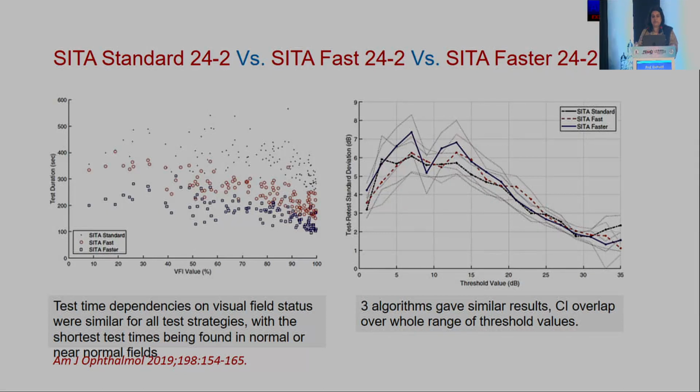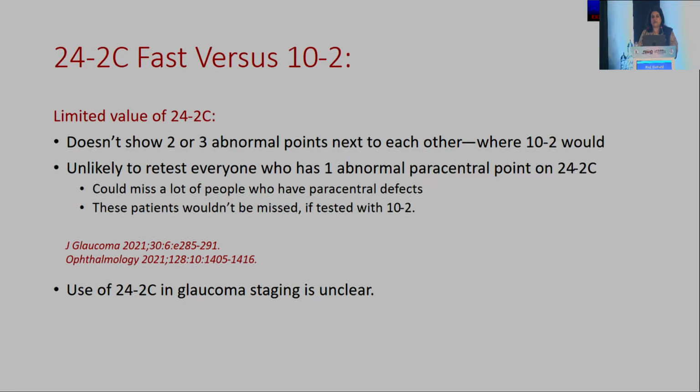The test time depends on the visual field status, and the results which the 3 algorithms gave have been shown to be quite similar in several studies, and this was one of the major studies which showed that the confidence intervals overlap over a whole range of threshold values.